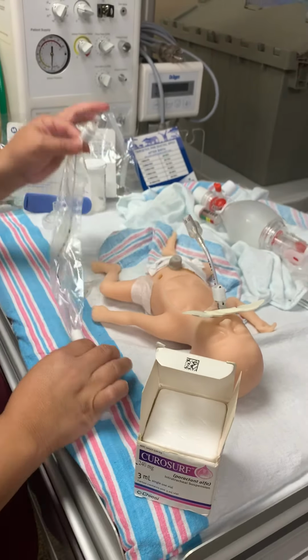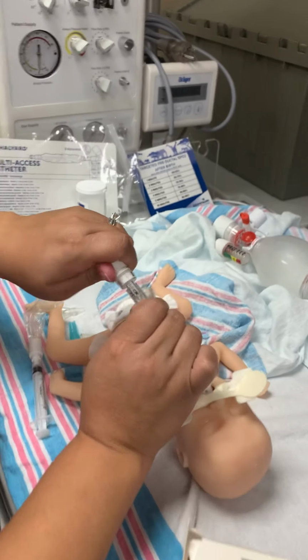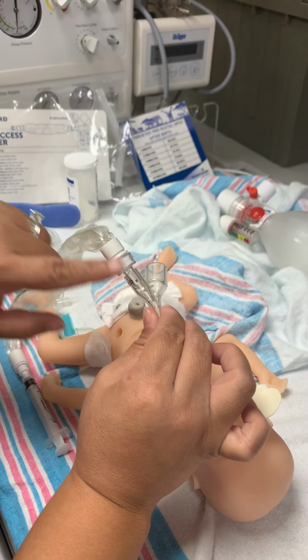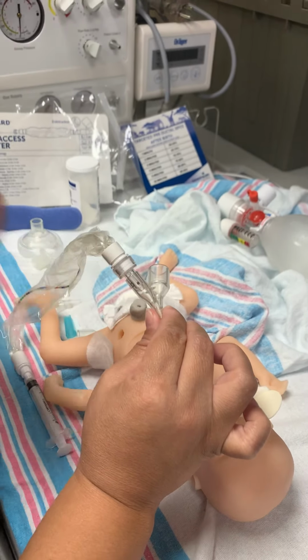So we of course want to keep this clean. We don't want it to hit the bed. We are introducing it into the patient, so we do not want it to be dirty, because then we can get VAPs and all that stuff. So we want to keep this in the packaging and just add it here. Now this side is for the surfactant catheter, of course, and this side is for the actual bagging of the patient.